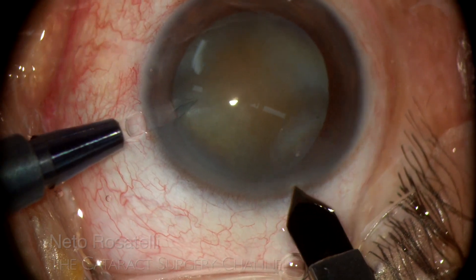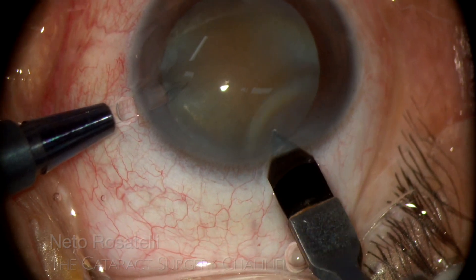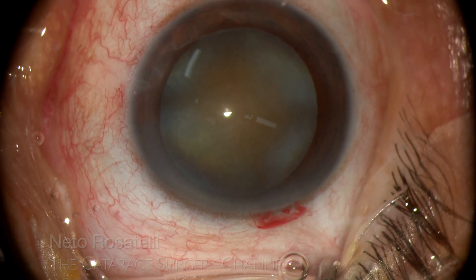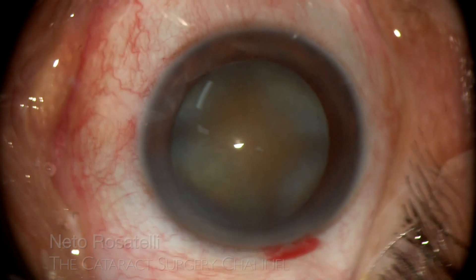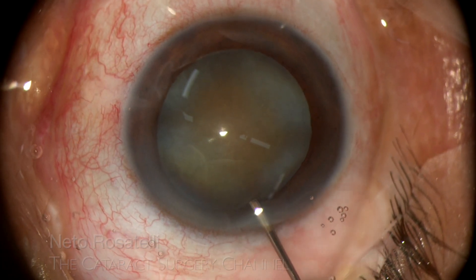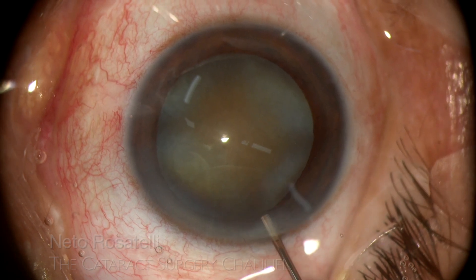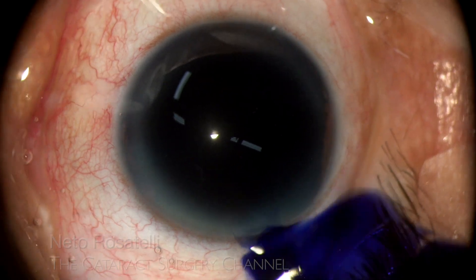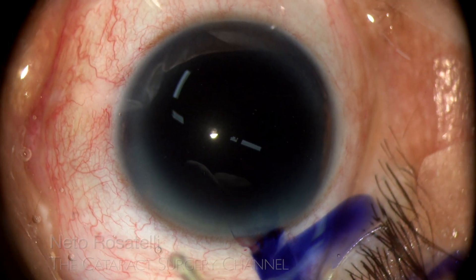Incisions are being done with a 2.75 black diamond keratome and a 1mm stab knife. It is a hard cataract that was on its way to become a white one with a very hard brownish nucleus, perhaps with some entumescence, and luckily the patient got the opportunity to be operated before that.